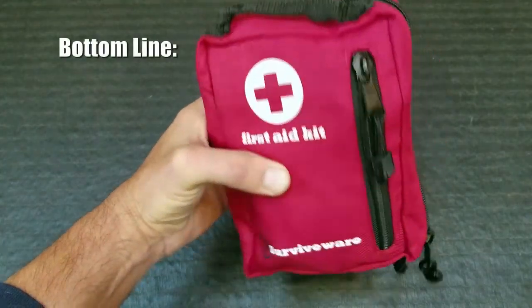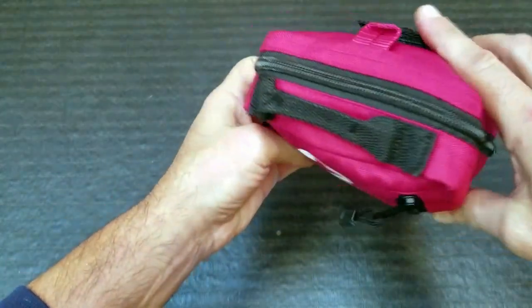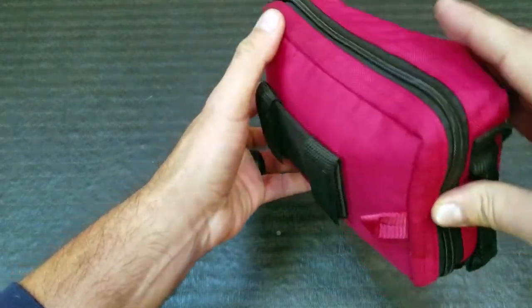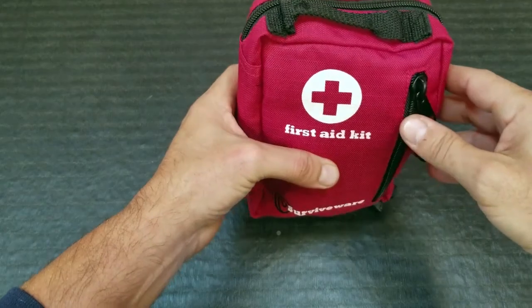Bottom line, if you are in the market for a first aid kit — be it for field use, vehicle use, or even in a home — take a look at this kit made by Surviveware. You may be pleasantly surprised. I know that I was. This is Helder. I hope that you found this review helpful.